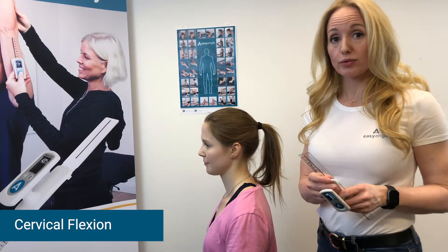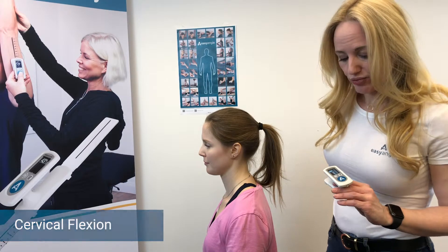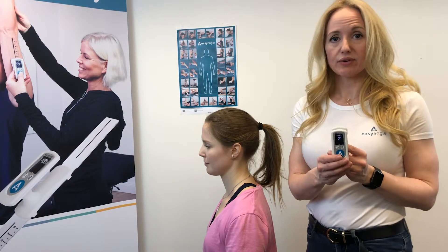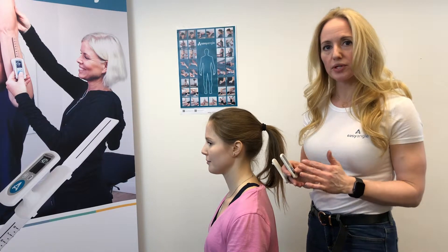The first thing we do is pop the ruler off because we don't need that for this measurement. We press the button to get our blinking zeros, which tells us that we are ready to set the plane in which we want to measure.